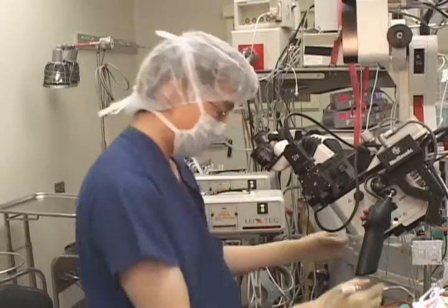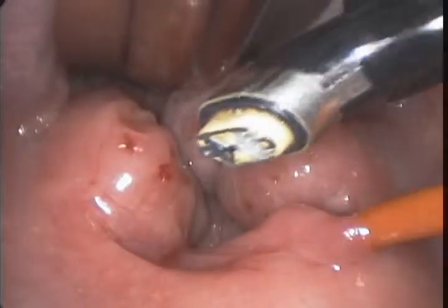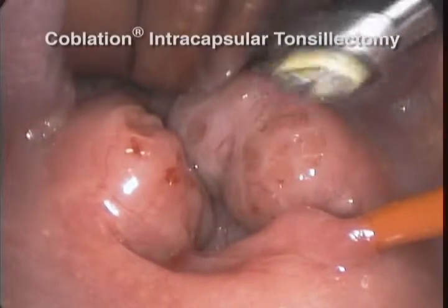We've been using coblation technology for several years now with very good results to perform intracapsular tonsillectomies. The patient that we'll be doing today is using the Coblator 2 device with the EVAC TNA wand. We are going to be performing bilateral intracapsular tonsillectomy using the EVAC TNA wand.